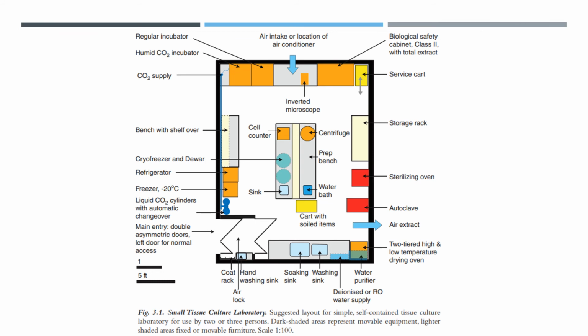Here we see that the wash-up area is placed next to the main exit and the sterile handling area is placed in the other end of the room. The preparation and storage area lie in the center, thus creating a buffer zone.